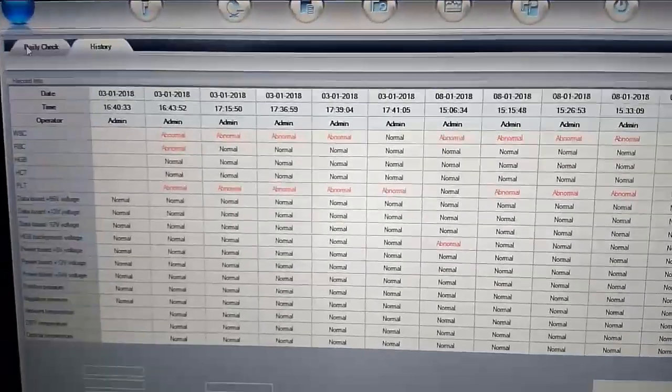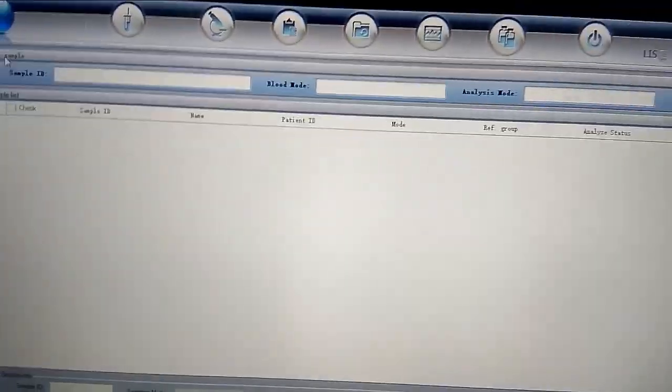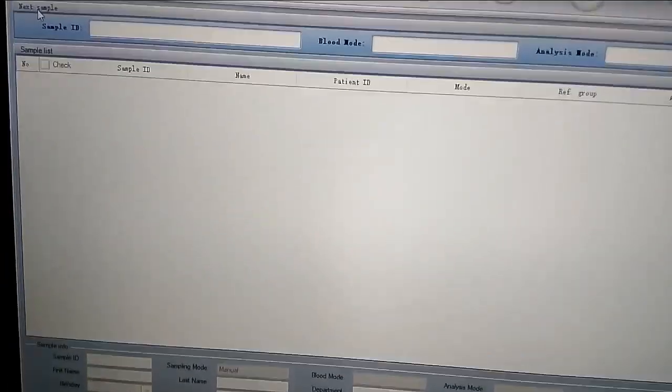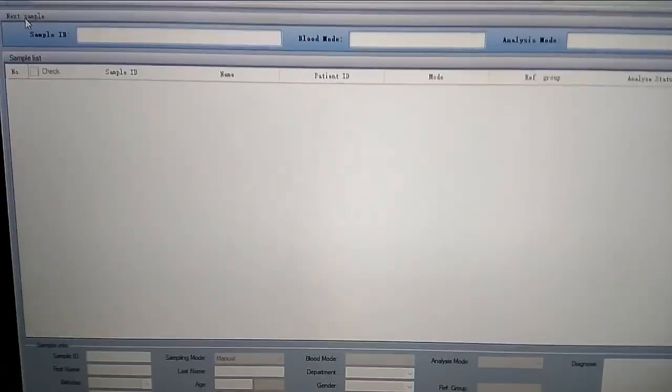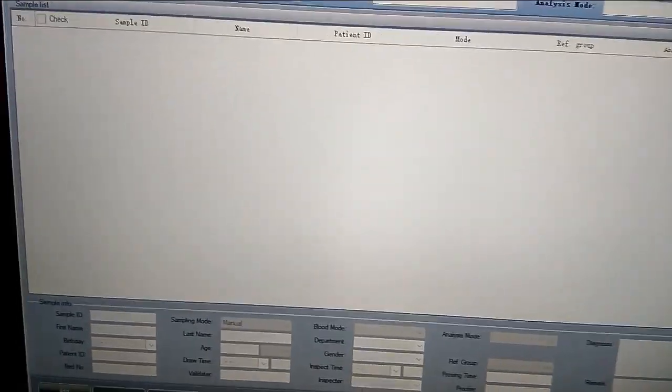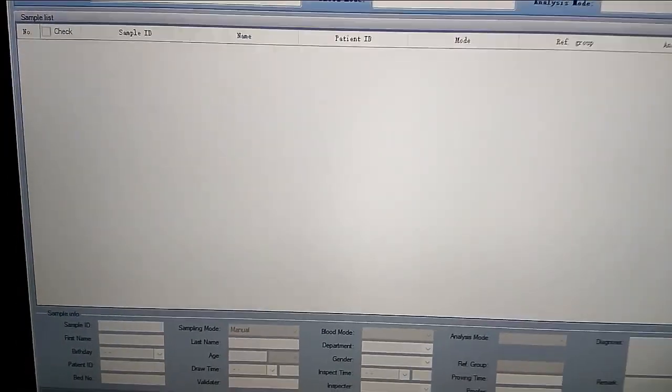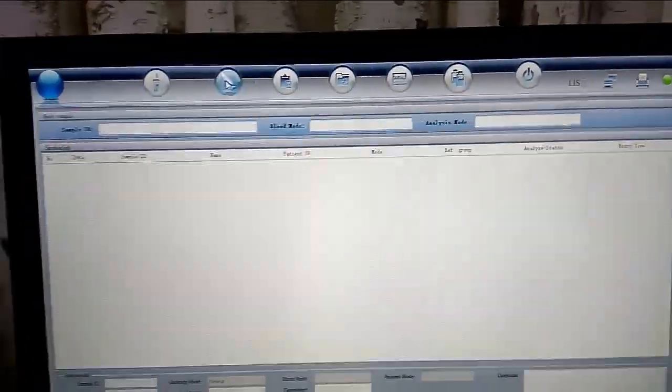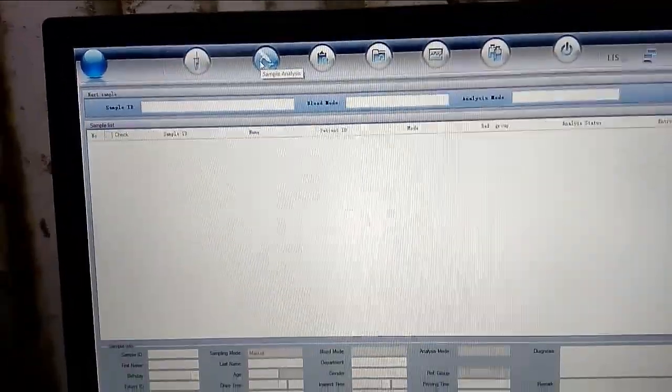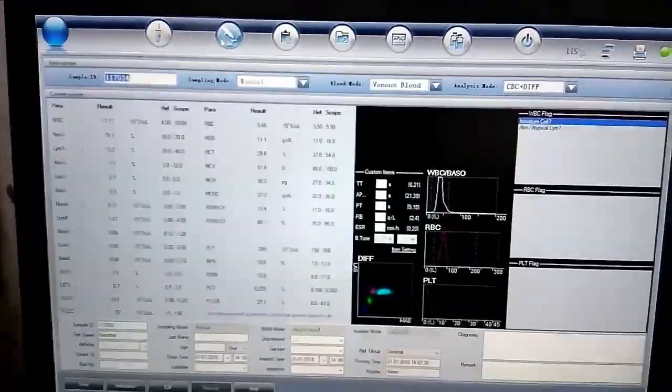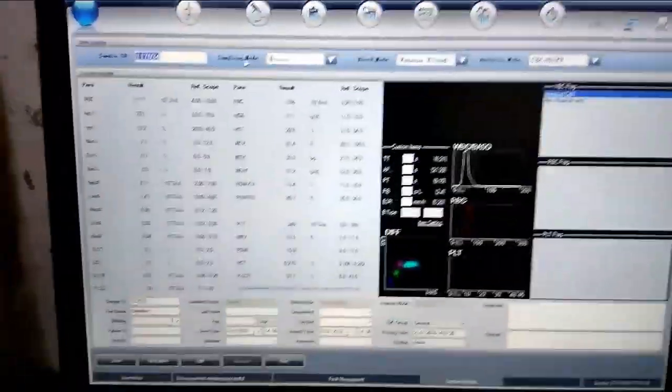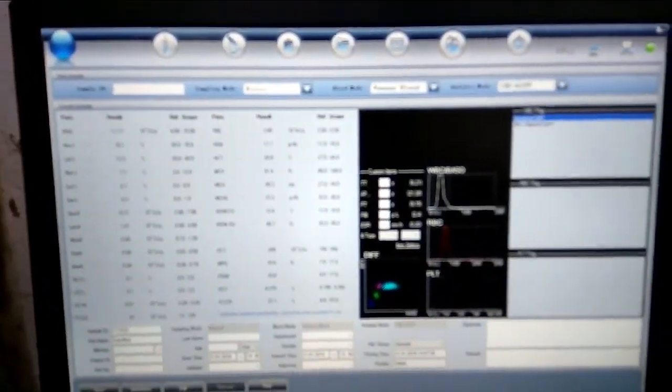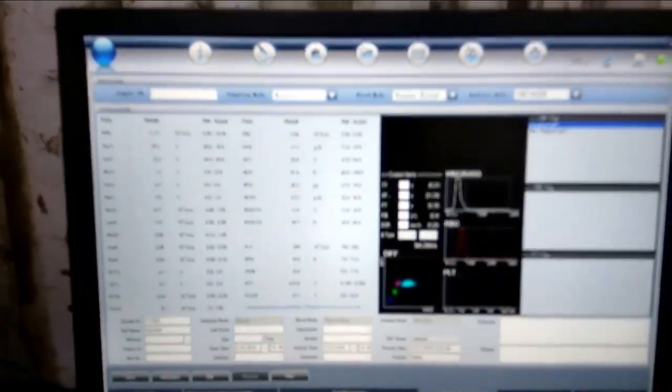If we check the patient's ID with a checklist in order to run. First click the sample analyzer. Click the sample ID and we will start the sample.